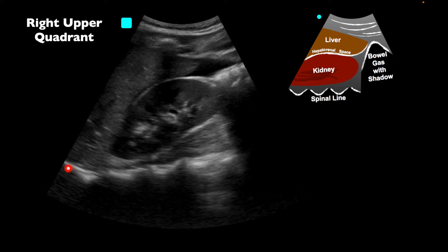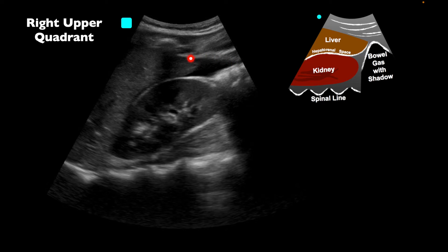When we look at the thorax, remember we do want to see above the diaphragm. In this case, however, we don't — so we could not determine if there's free thoracic fluid. We don't see any fluid between the kidney and the psoas muscle, so it doesn't look like there's a retroperitoneal bleed. But we definitely have intraperitoneal fluid that is noted.